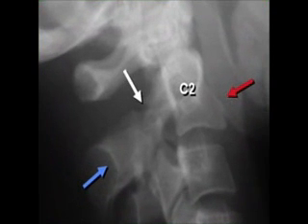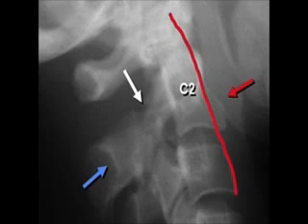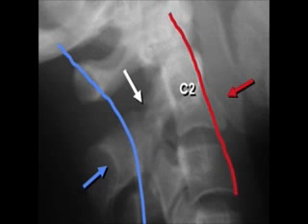This is an example of a hangman's fracture of C2. The white arrow points to the vertical lucency, which is the fracture itself through the pedicles of C2. The red arrow points to the anterior subluxation of the body of C2. The red line should smoothly connect all of the anterior bodies but it doesn't, and the spinal laminar white line of C2, indicated by the blue arrow, is clearly posterior to that blue line.